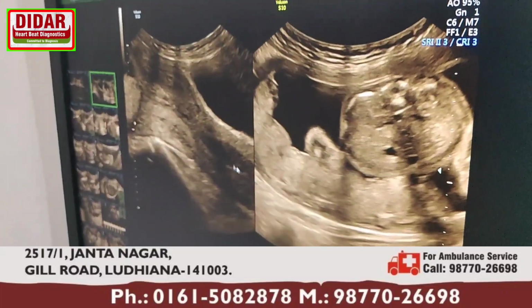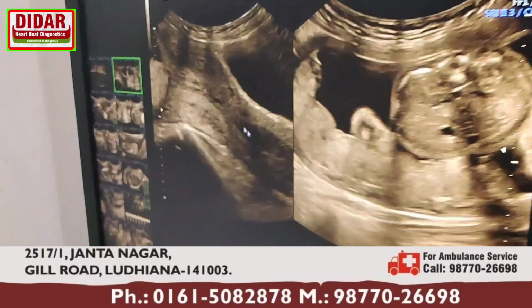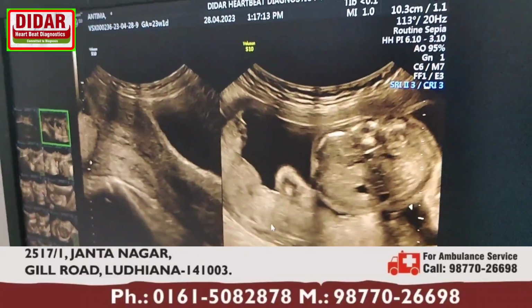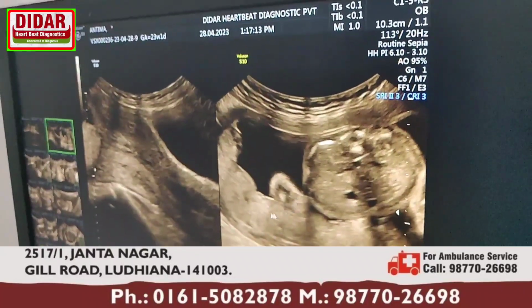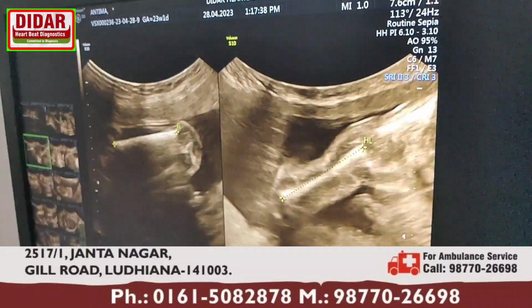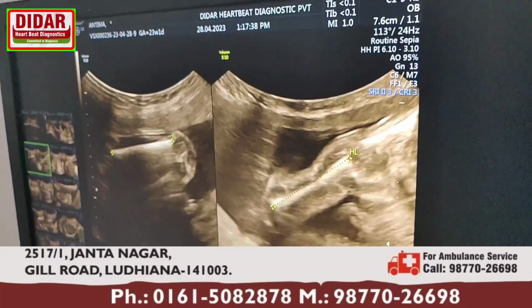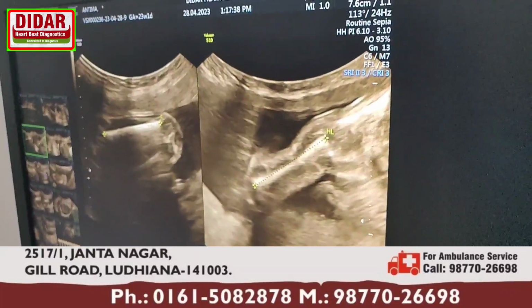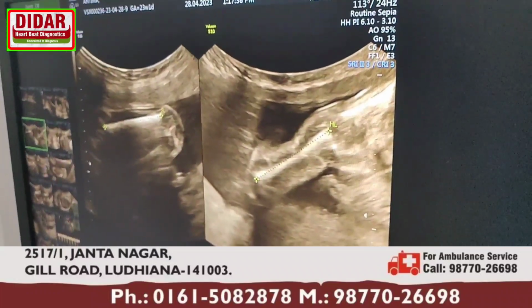It is long and the internal os is closed. And second, I see the placenta, from where the baby is connected with the mother. So we see the position of the placenta. Then I measure bones, femur length and humerus length, like the thigh bone and the arm bone.